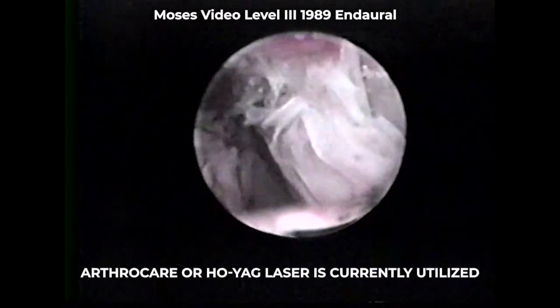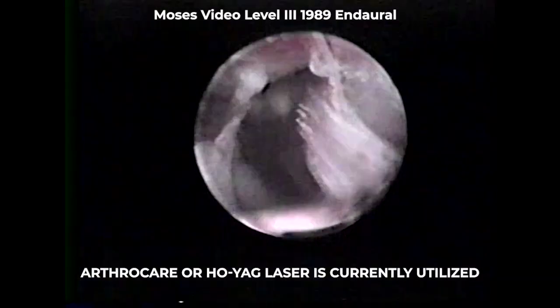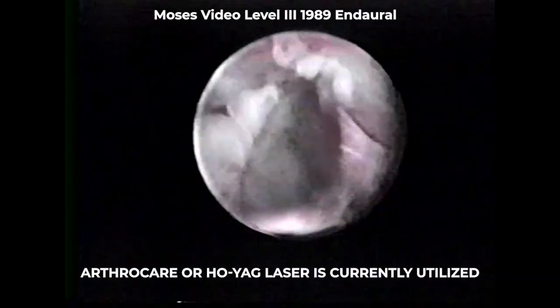Due to their adherence, it was felt that a pull knife would be better utilized. Here, you can see this being used for the lysing of the adhesions.